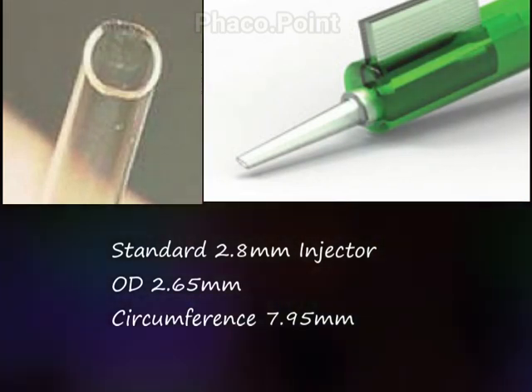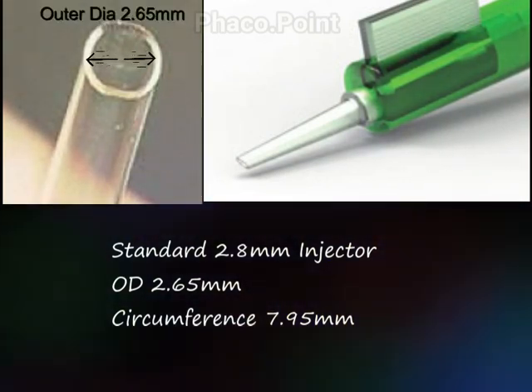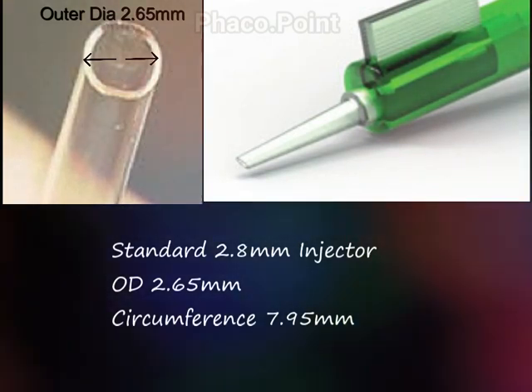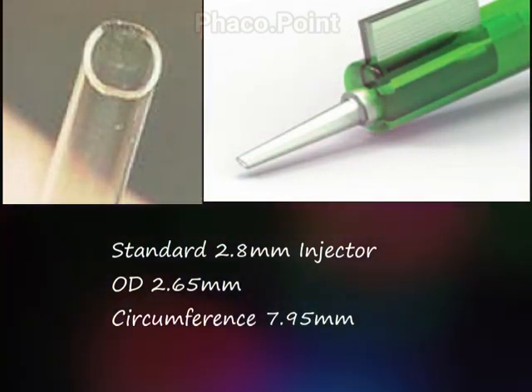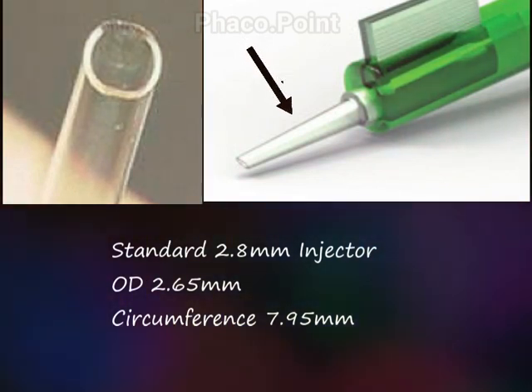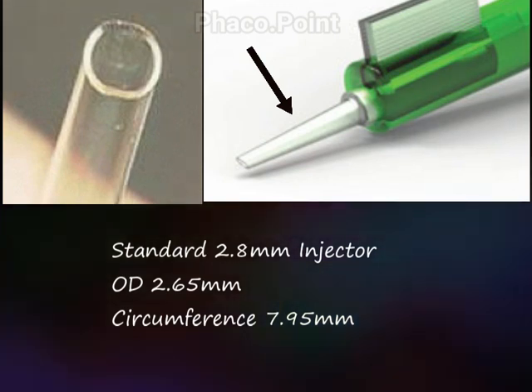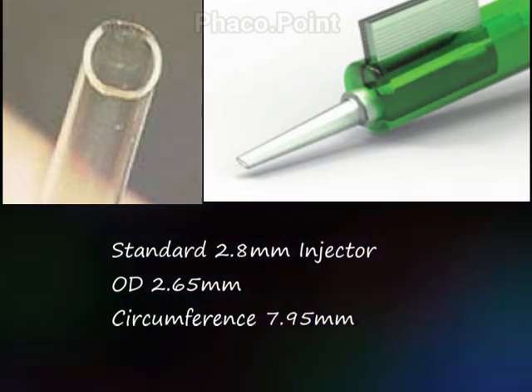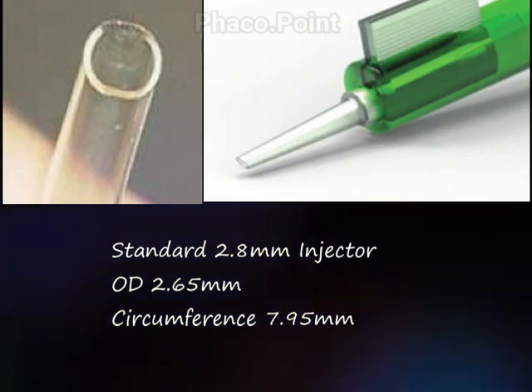A standard 2.8 mm injector nozzle tip has an outer diameter of 2.65 mm with a circumference of 7.95 mm. In addition, the cone-like configuration of the nozzle means that the more you push the nozzle within the incision, the greater will be the distortion — which is the reason why you saw such a gape of the incision.